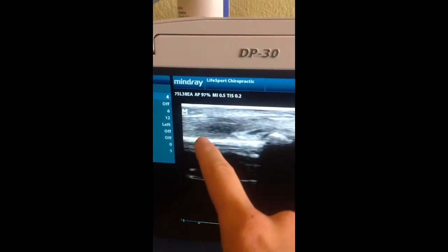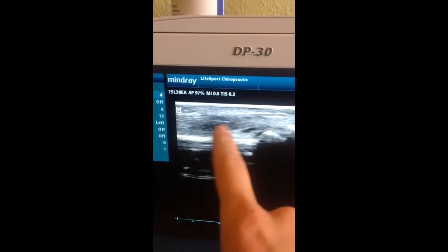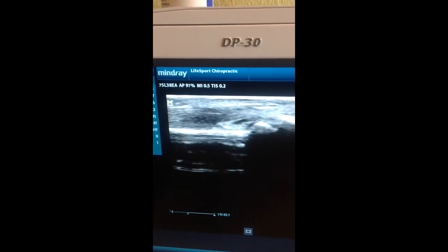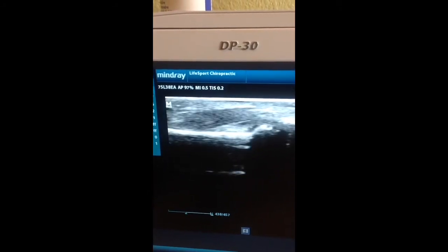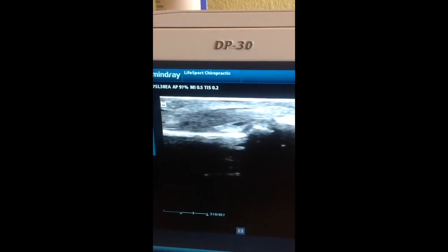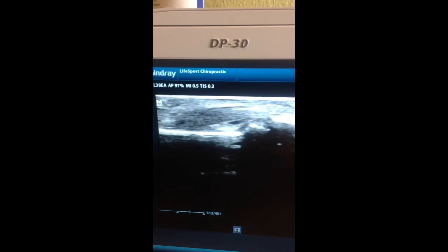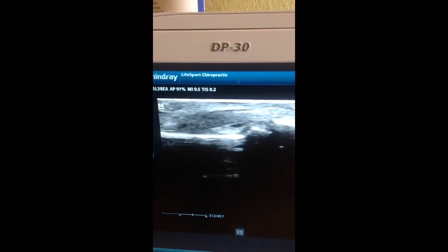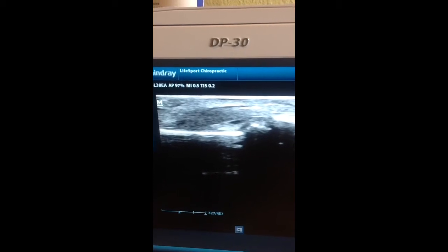Sometimes there are tears and we can see little black spots — this is normal, however. As we change the view, putting it in movie mode, it gives us thorough feedback of what we're looking at. Sometimes you see little spots like this one over here, and then as you change the view just slightly, we realize it was just distortion.